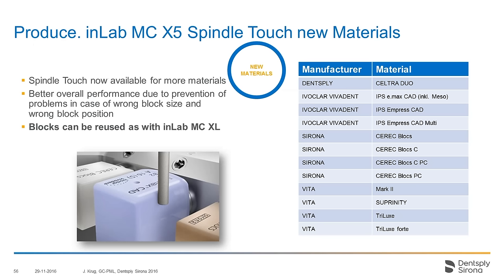We improved the spindle touch for the remaining materials, so almost all glass ceramic blocks will be touched before the milling or grinding process starts. You can see the list of which materials will be touched on the right side. This makes it more secure that the user is not using the wrong block size for a restoration, avoiding destroying the instrument or dislodging the block from the holder.